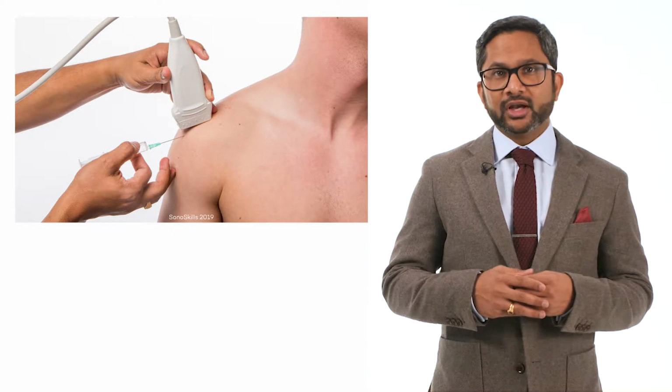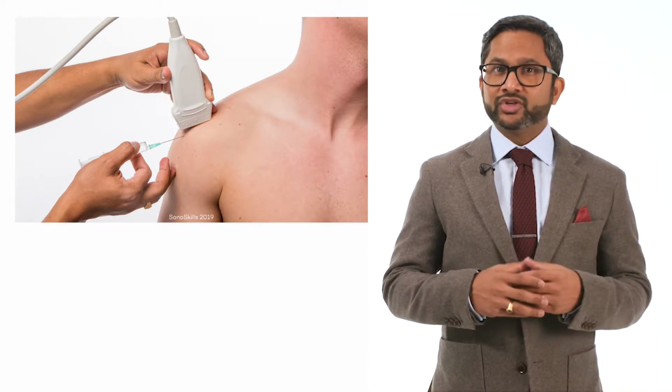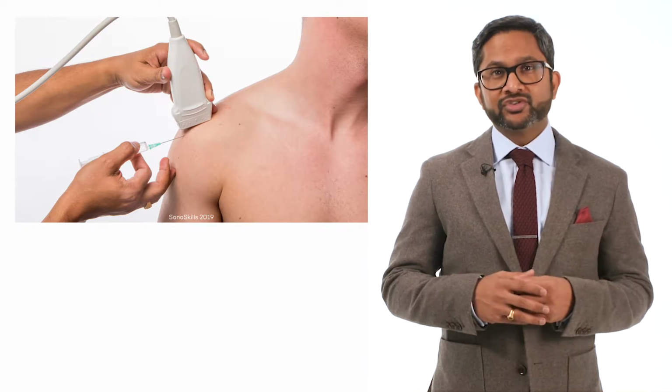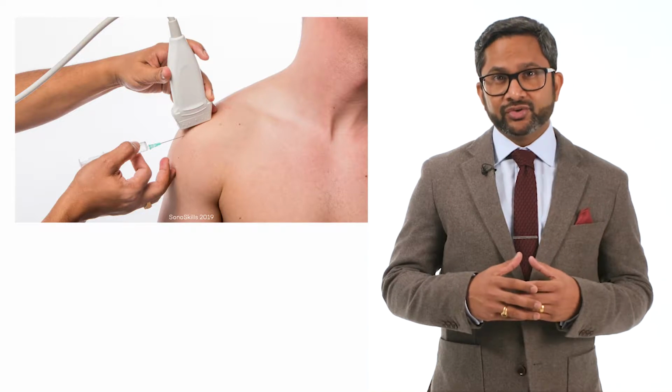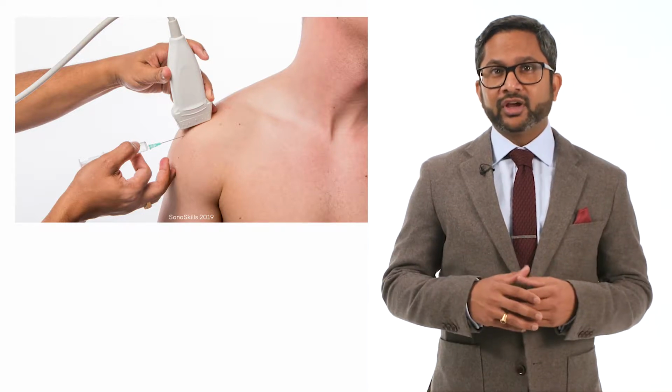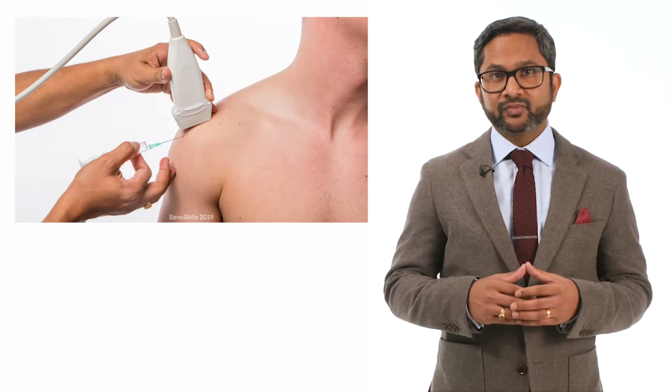Ultrasound-guided procedures allow the clinician to differentiate between the type of pathology, the pathology location, and certain pathology details, whether the pathology is acute or chronic, or if the ultrasound findings are a result of normal anatomical variations.